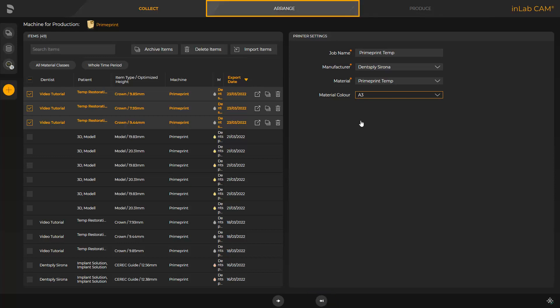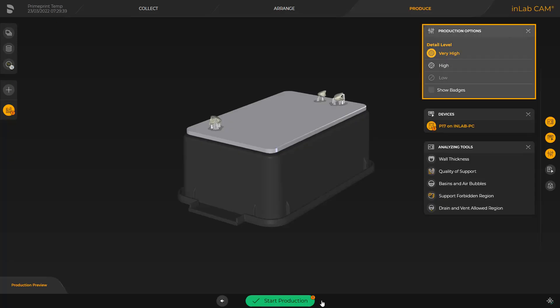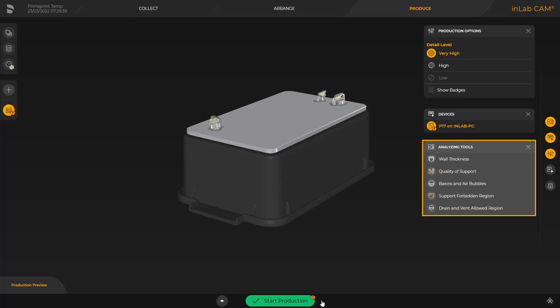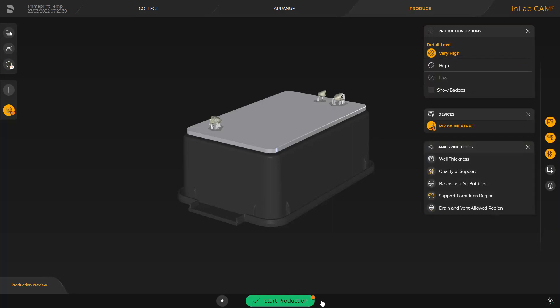Fast track will take you directly to the last phase, produce. In this case, the InLab CAM software automatically positions and orients the print objects on the build platform and also defines the support structure automatically. Detailed information about the InLab CAM software can be found in another video tutorial. We click on the double arrow and can finally modify the detail level in the window under production options and analyze the print object with the analyzing tools. To start printing, we tap the green area labeled start production.